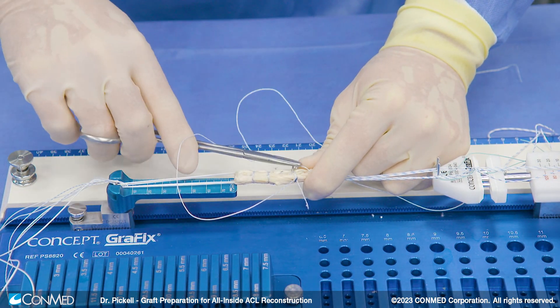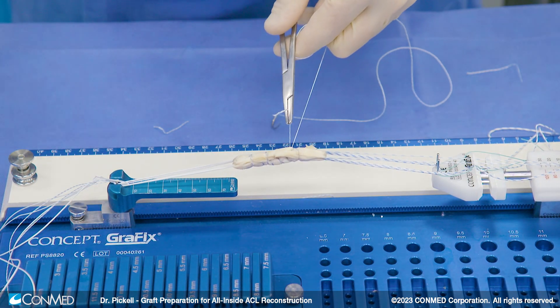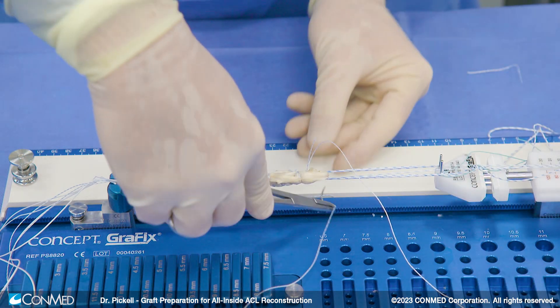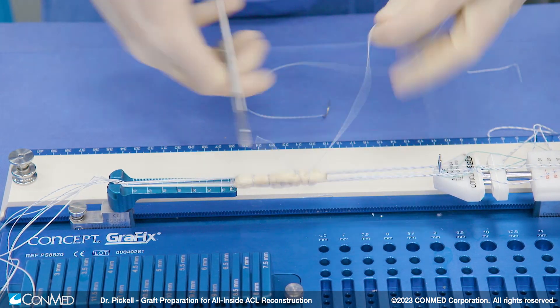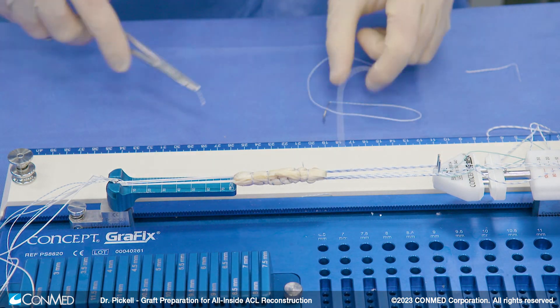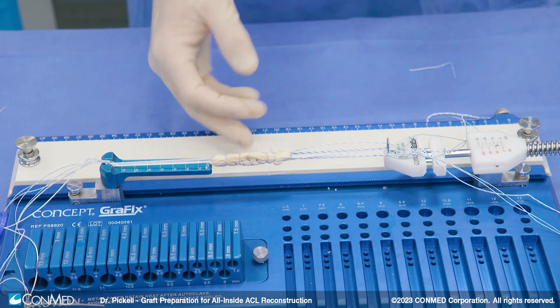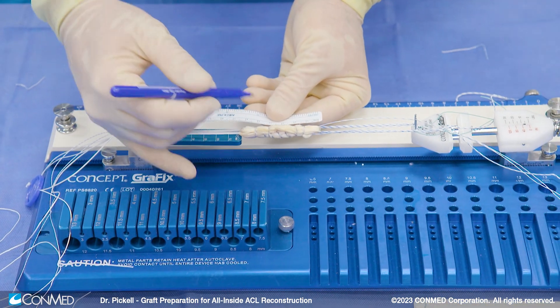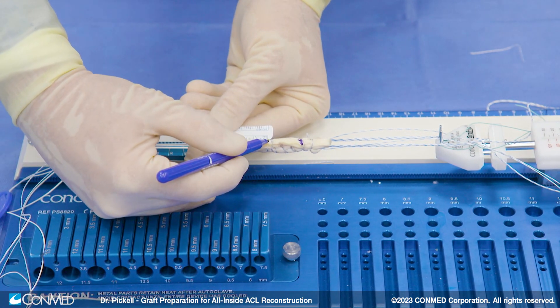There's our third stitch done. We try to make it so the bailing stitch ends up nice and compact. We'll repeat that one more time — far end again, going from inside to outside, wrapping it around one last time, then again from outside to inside. Tension it and tie it off, and there's our final product. The last thing I do once I've passed all of my suture limbs is put it under a little consistent tension to take any creep out of the system, making it a more reliable graft without any excess stretch when we go to implant it. One final step that I think is important for all-inside is to mark our ends so we know when we've dunked our tendon into the socket — I just put a little mark about 20 millimeters from either end, and that's going to help us when we're putting our graft into the sockets at the end of the case.